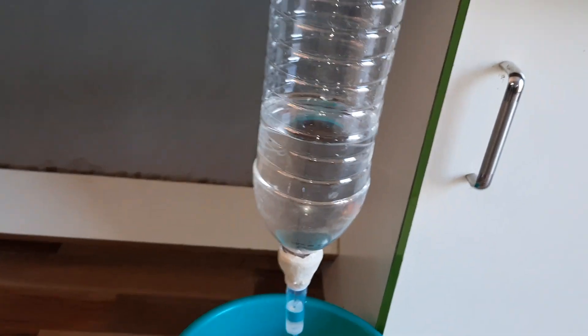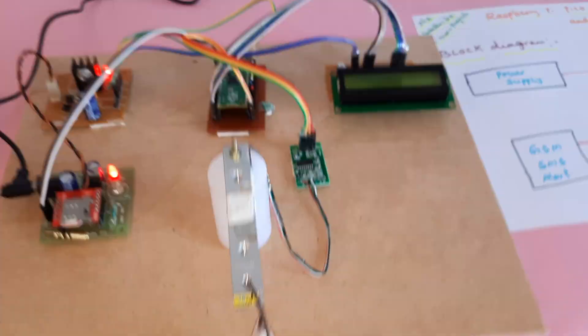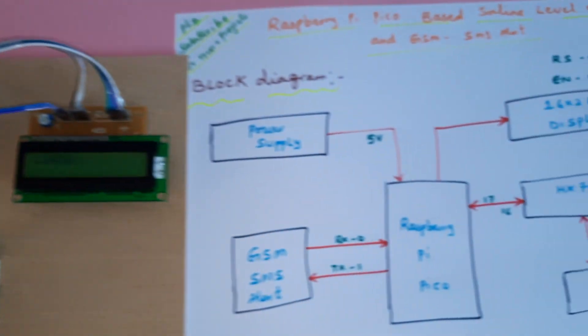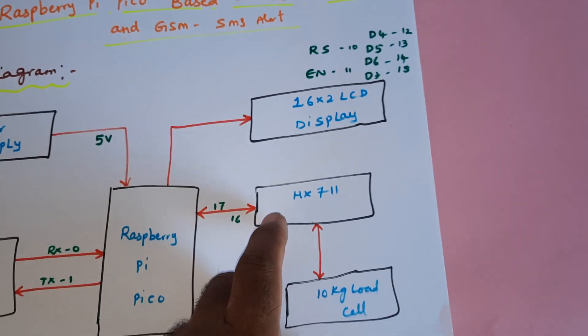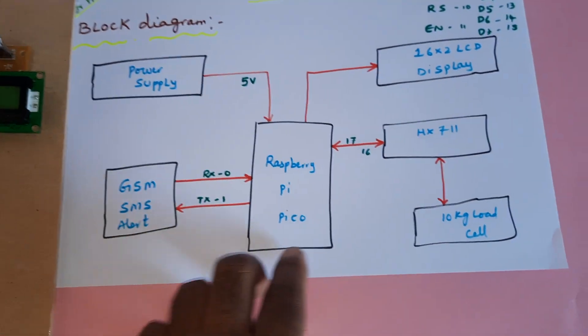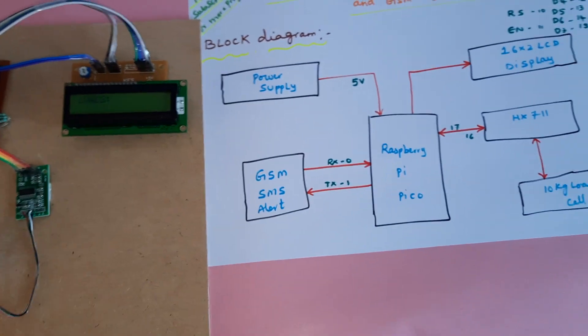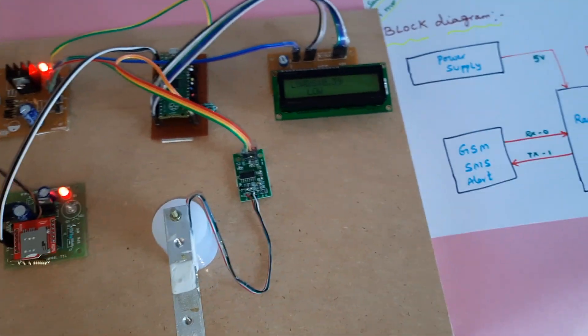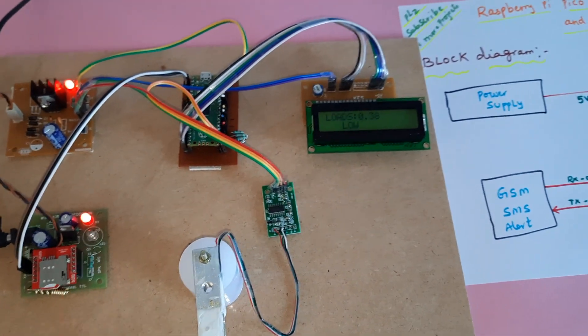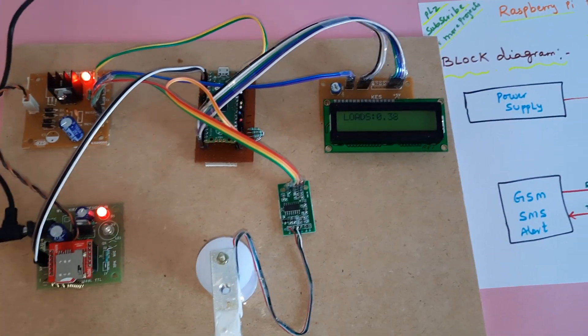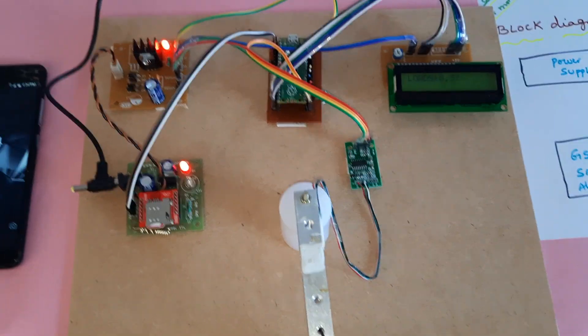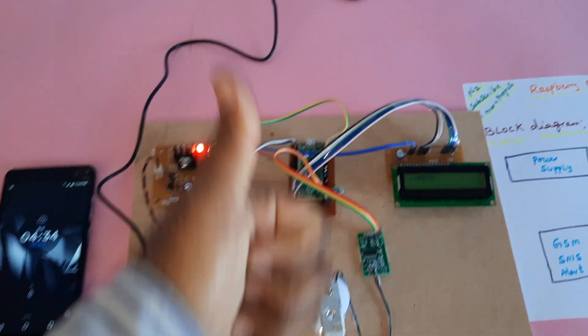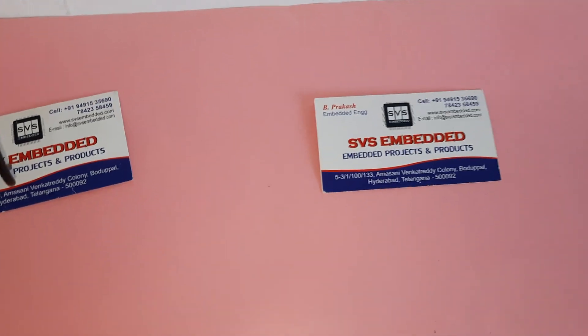The system includes power supply module, Raspberry Pi Pico, LCD, HX711, and GSM module. We can add a Wi-Fi module to enable monitoring on Blynk app, ThingSpeak, or a custom website. This IoT project can be connected to the internet for remote saline bottle monitoring. Thank you. If you have any doubts, contact SVS Embedded.